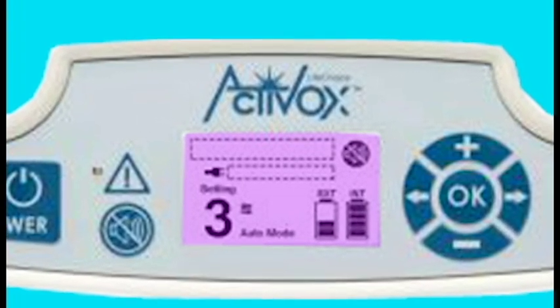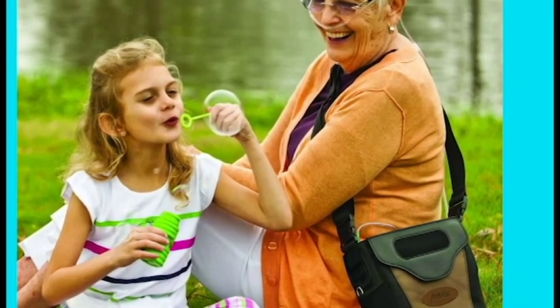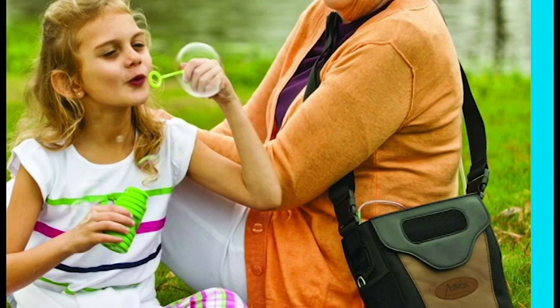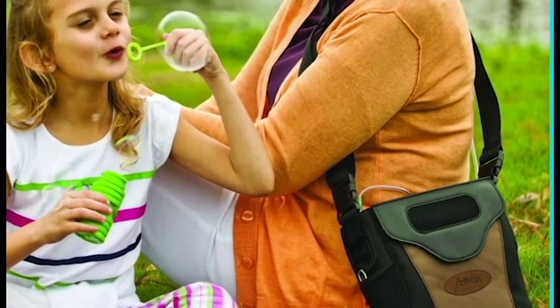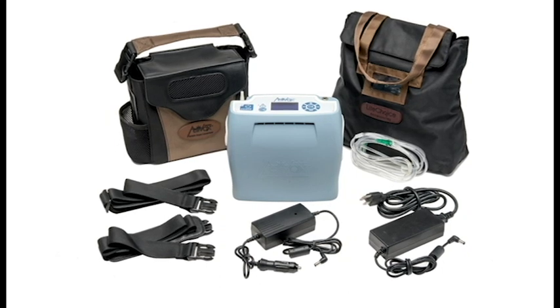You're going to look at a unit that still has that quiet pulse wave oxygen delivery and still has that sleep mode technology. The concentrator is going to come with your usual AC and DC power supplies — that's your wall and car chargers.